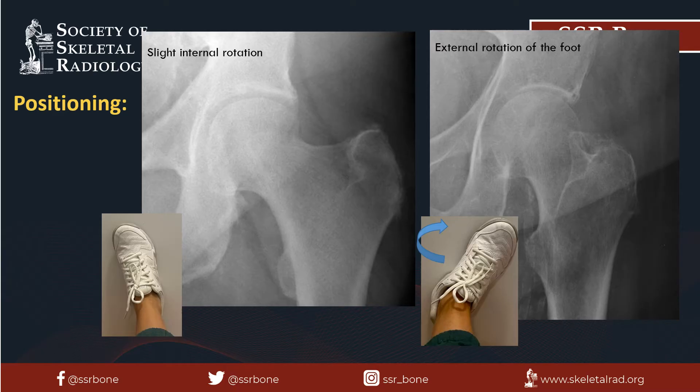The patient is placed on the fluoroscopic table supine with the hip being injected closest to you. The foot is placed in slight internal rotation so the femoral neck is well visualized. If the patient's foot is in external rotation, this results in the greater trochanter obscuring the femoral neck landmark. A sandbag or tape can be applied to assist the patient in keeping their foot in slight internal rotation if needed.